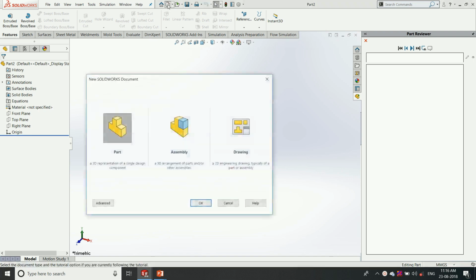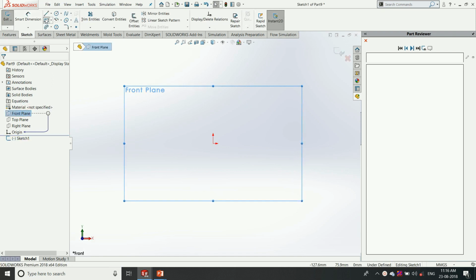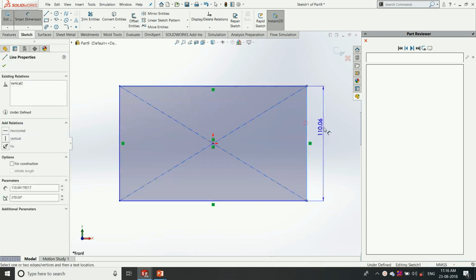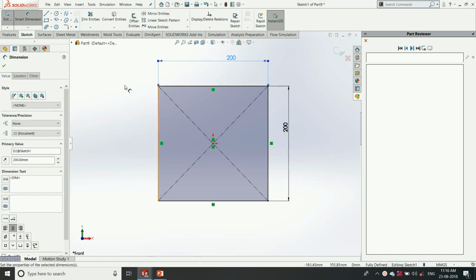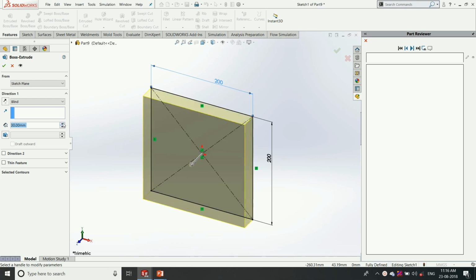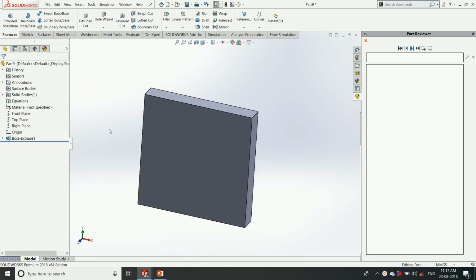Now I'm going to choose a new tab. In this window we can choose which plane we are going to draw on, and by just clicking the rectangle option and using mouse gestures, we can choose the dimensions. Then after creating the 2D sketch, we can directly create a three-dimensional object by just clicking the extrude option. Here we can choose the amount of 3D content, or the adding of the solid component to the sketch. By just clicking, this 2D sketch will be automatically converted to a 3D model.